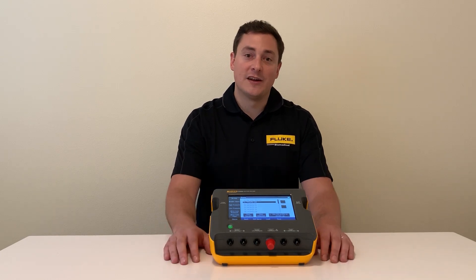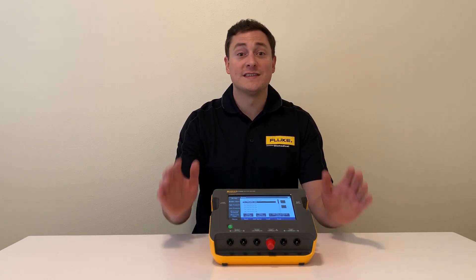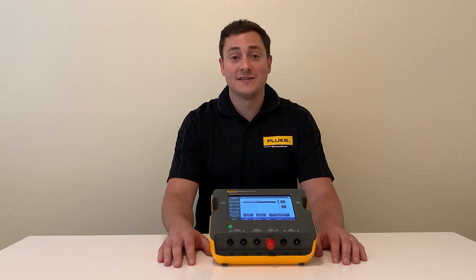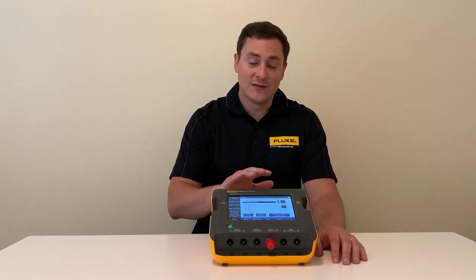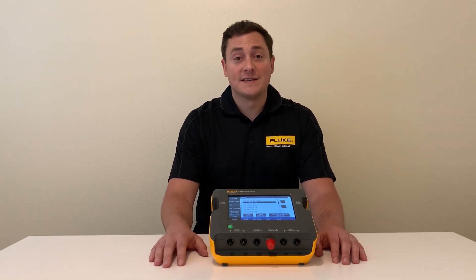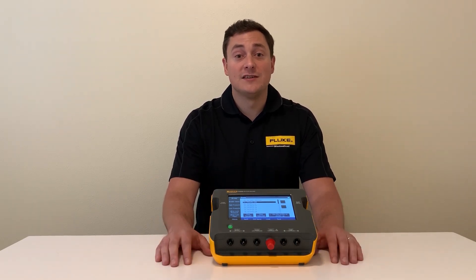The unit also has an eight-hour battery life and onboard memory, so you can stay out in the field, do all of your testing, and not worry about your test results until the end of the day. You can download them with the Excel add-in and populate those into your test reports to make the job easy as well.